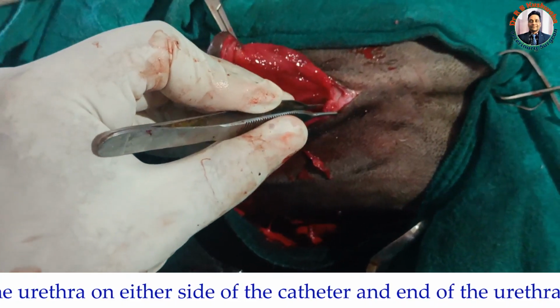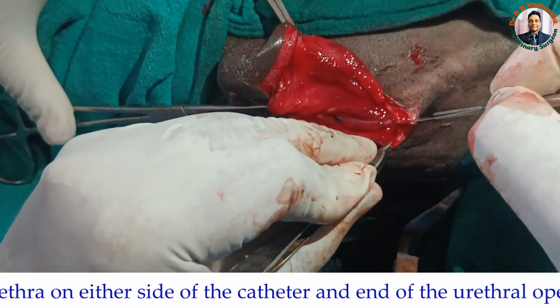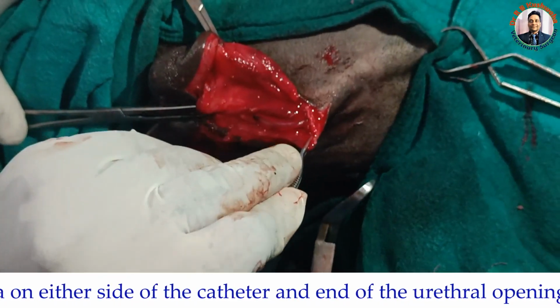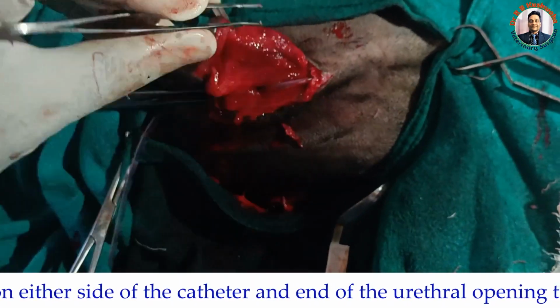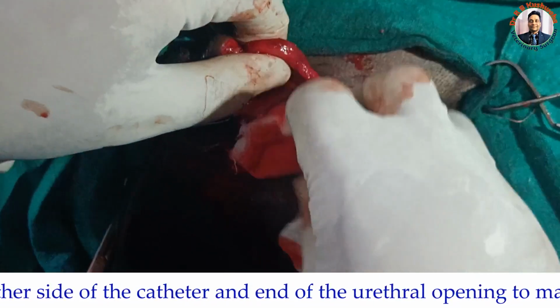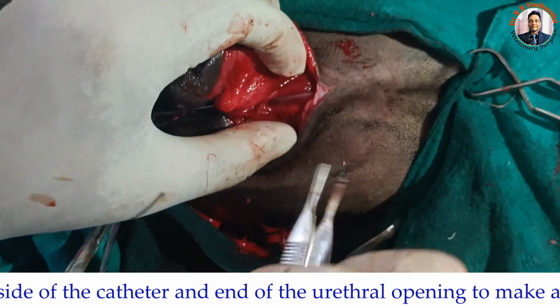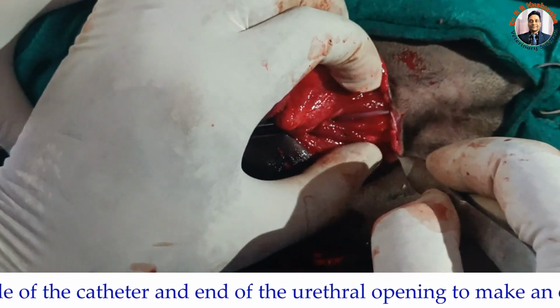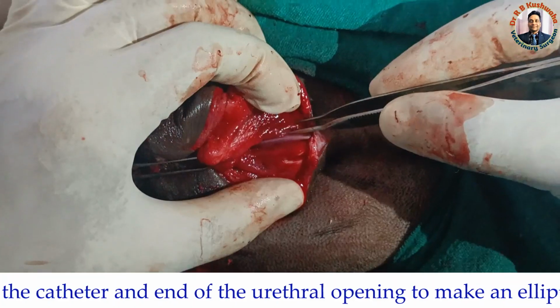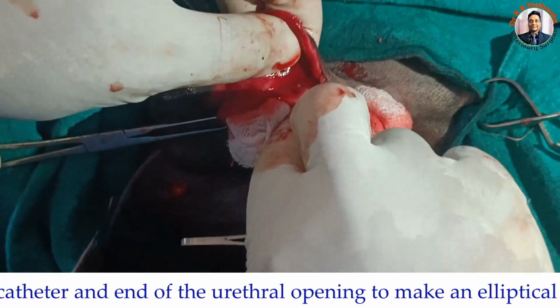So we make a corner here a bit. It is very difficult to appreciate because it is a very fine incision. Now you could see, this one is the catheter and I make the incision here. Now you could see here, this one.